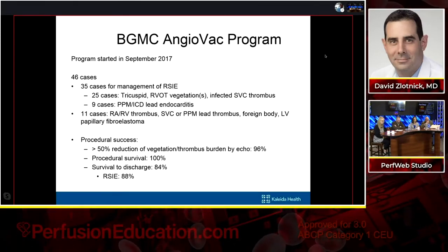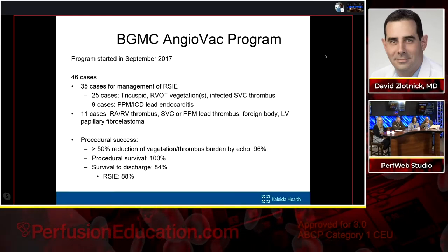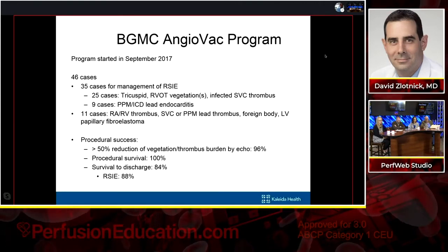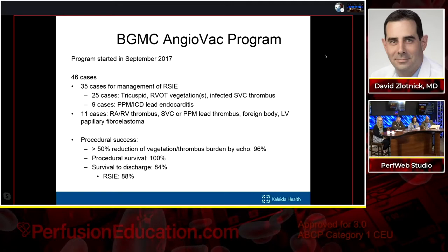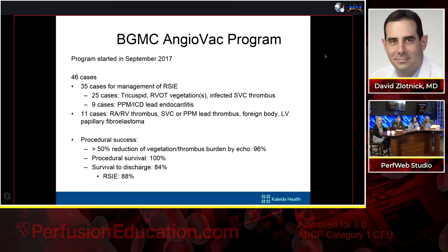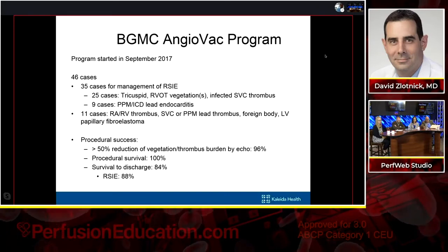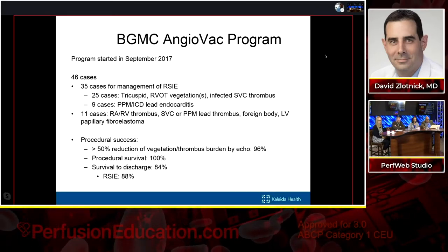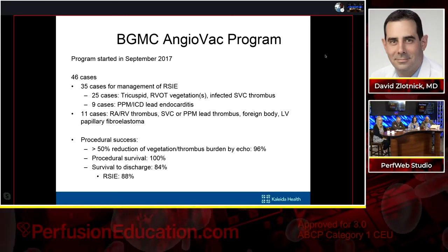And so we started our formal program in September of 2017, so we've just been a little bit over 2 years into our program. We've done 46 cases, 35 for the management of right-side infective endocarditis, 25 for tricuspid RVOT vegetations or infected SVC thrombus, 9 for pacemaker ICD lead endocarditis, and we've done 11 cases for RA RV thrombus, SVC or pacemaker lead thrombus, 1 for foreign body, and 1 for an LV papillary fibroelastoma.